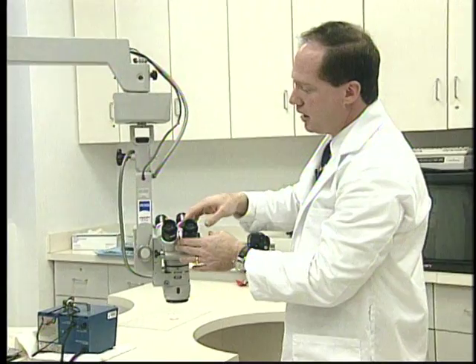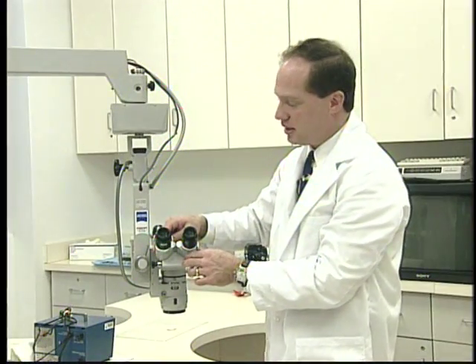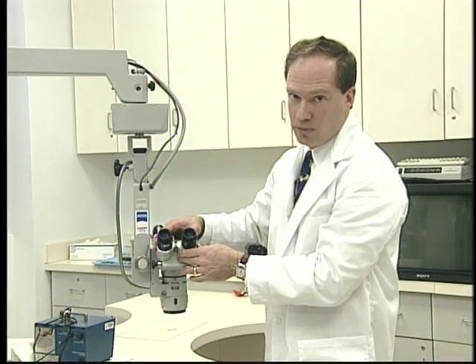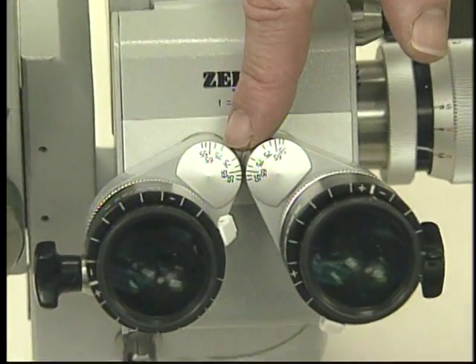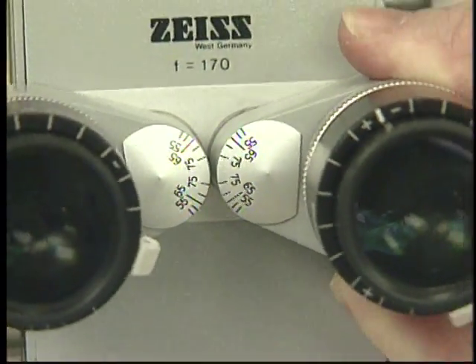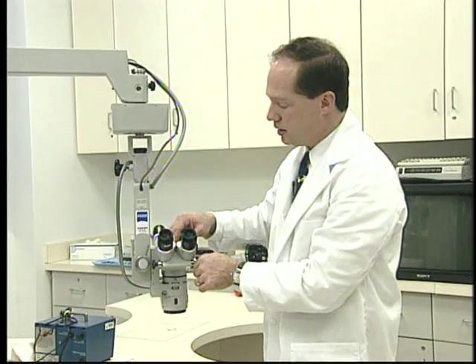like that. Now the eyepieces are also adjustable frequently. First thing you need to learn is your interpupillary distance. Everybody's is different. Some people have close-set eyes and some people have wide-set eyes. The way to check that is to put your eyes and look through the microscope so that you see one circle, not two. If you're seeing two, that means that your interpupillary distance is off. And you can check it because there's usually a little number here that shows you what your interpupillary distance is. Once you know what your interpupillary distance is, it's a good idea to write it down, because then when you go to a different microscope, you can probably set it for the same position as a trial.